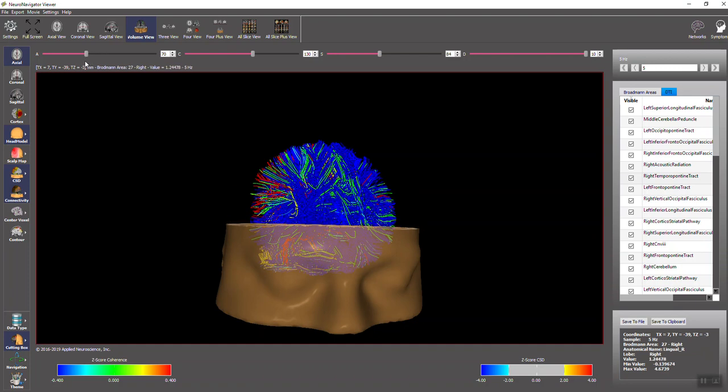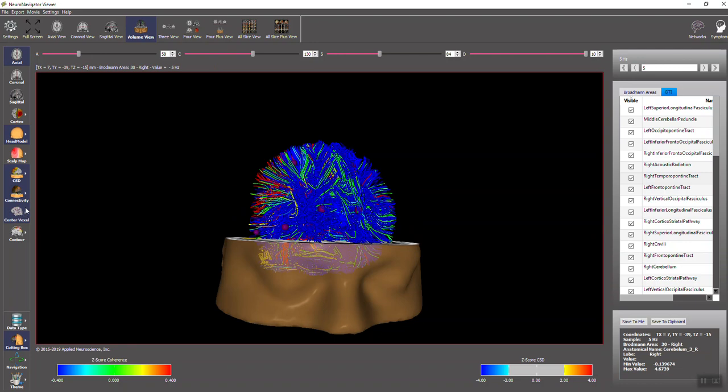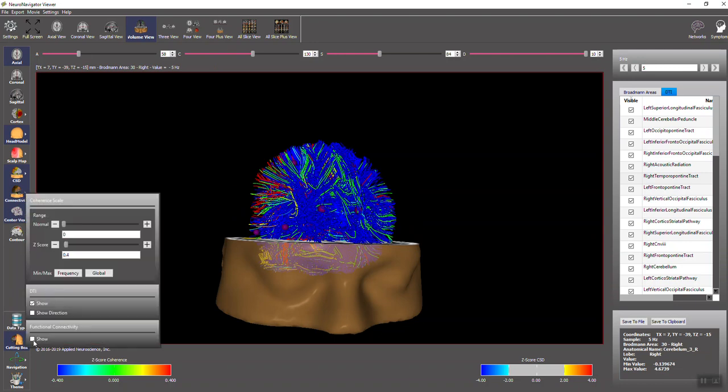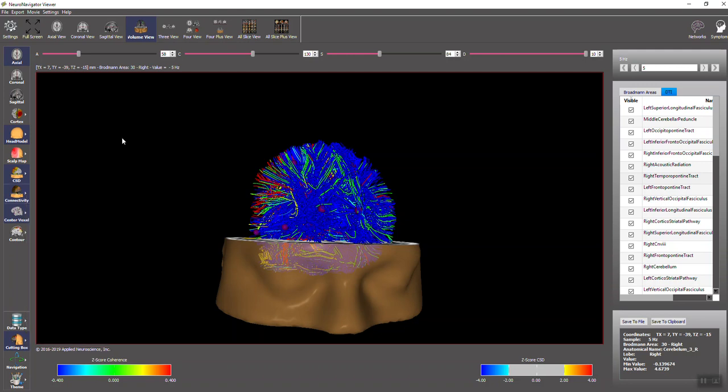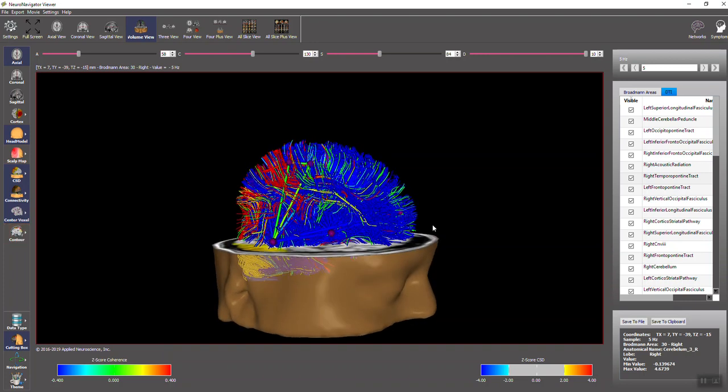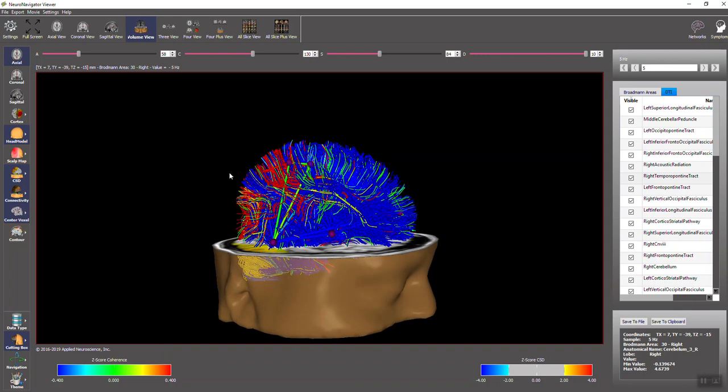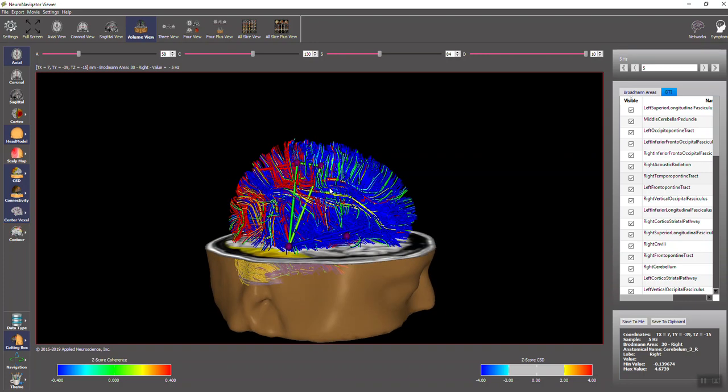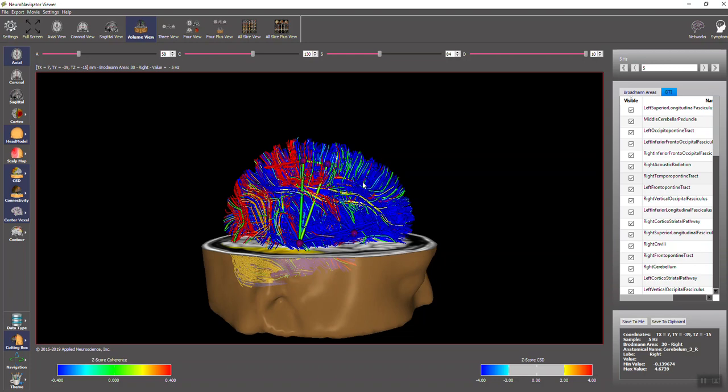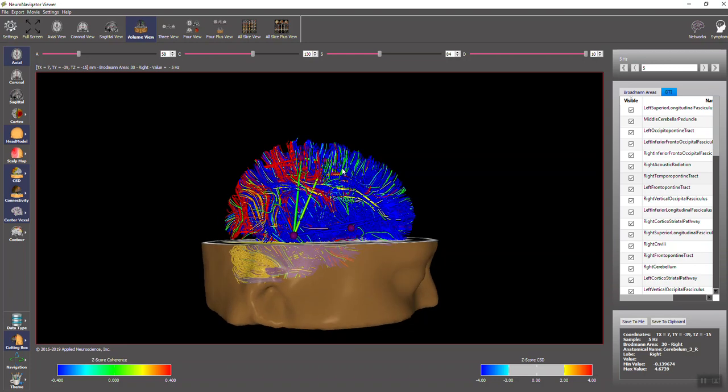And we also can at this time add center voxels. Those are the Brodman areas. Click connectivity and go to functional connectivity. And now we've added the regular Brodman area connections that we had in the past that are coordinated spatially in register with the diffusion tensor imaging.